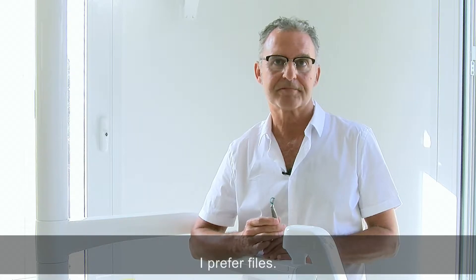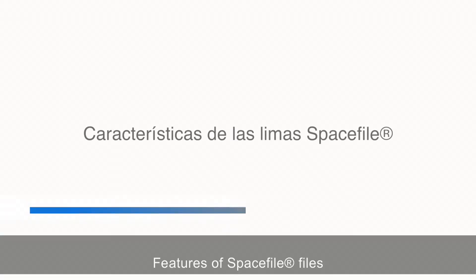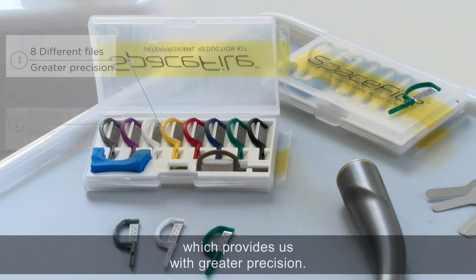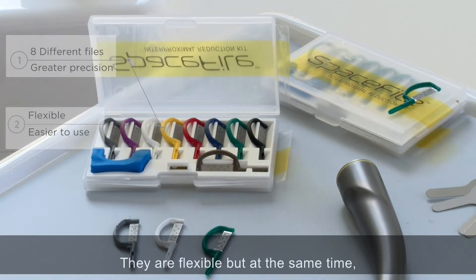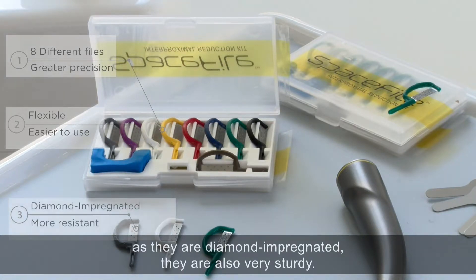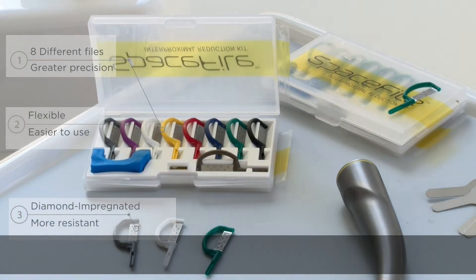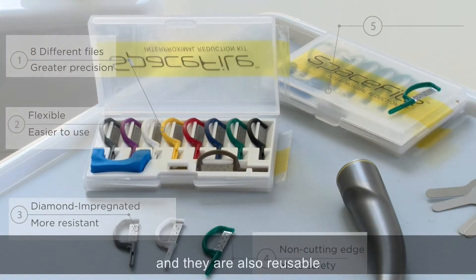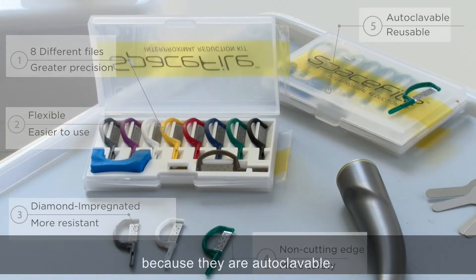I prefer files. Features of spacefile files: eight different thicknesses, which provide us with greater precision. They are flexible, but at the same time, as they are diamond-impregnated, they are also very sturdy. The lower edge is dull, which prevents us from cutting the gum, and they are also reusable because they are autoclavable.